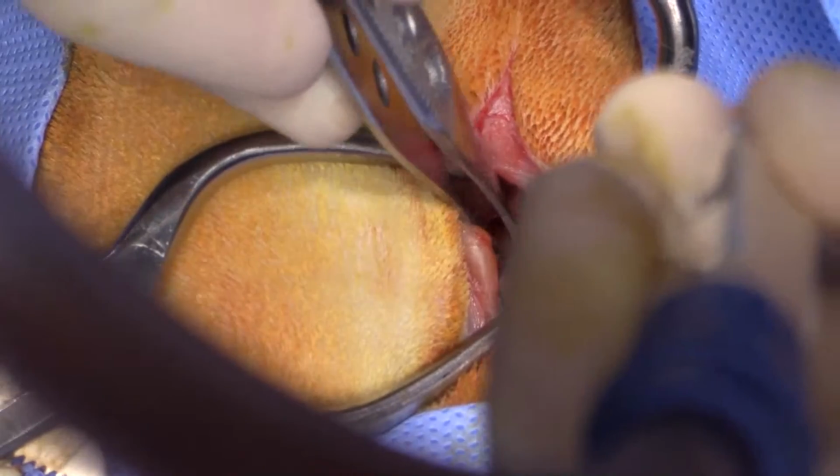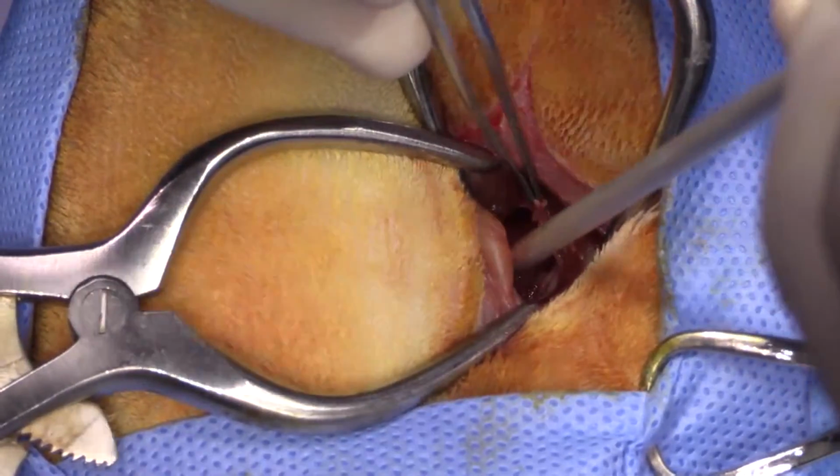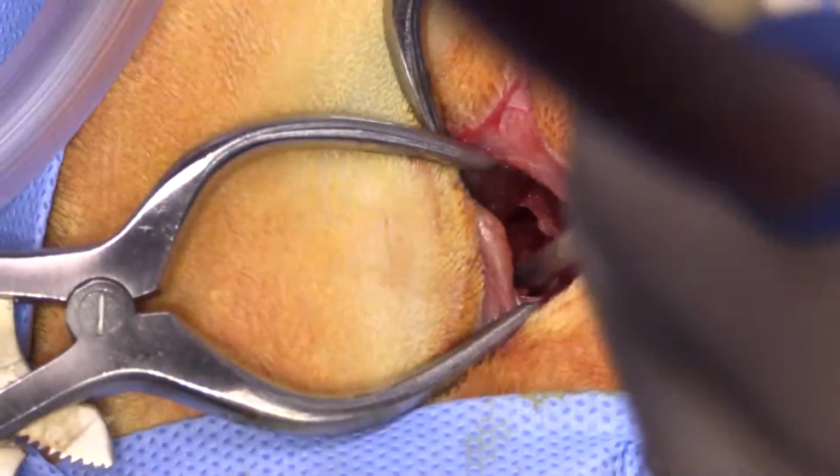So that is the lining that I'm pulling out. I'm going to be really careful with how far dorsal I go with my suction tip, so I don't damage the vestibular apparatus, which will be in the bottom of that bulla. So I'm pretty happy with the job I've done here.